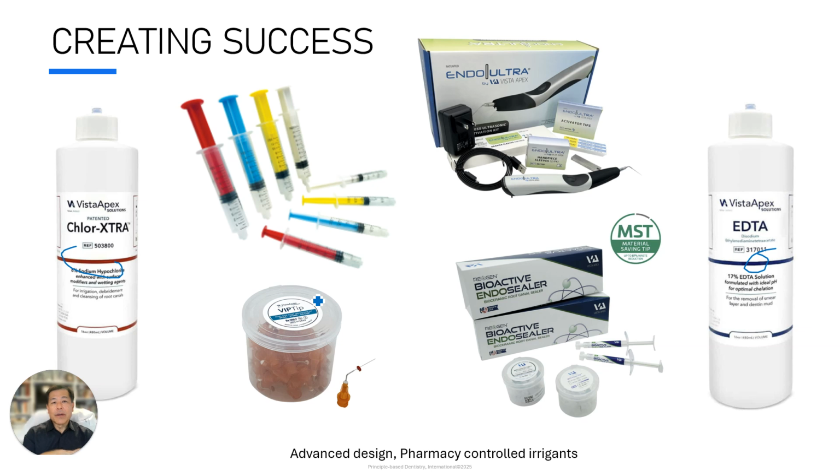I will tell you, this is how I do the majority of my root canals. I will get the patient in, numb them up, do the root canal, and create the final restoration if possible during that same visit. So it works great. Doctors have asked me, well, how do you do that? Well, what I do is I take the tooth, I prep it first so I have good circumferential margins.